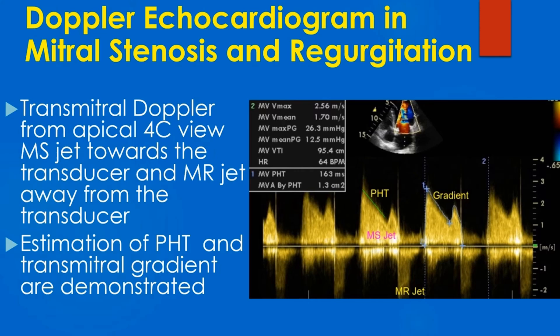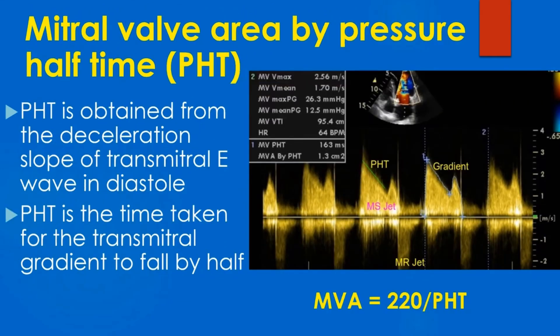Estimation of pressure half-time and transmitral gradient are demonstrated. Mitral valve area can be estimated from the pressure half-time of the transmitral gradient. Pressure half-time (PHT) is obtained from the deceleration slope of the transmitral E wave in diastole.